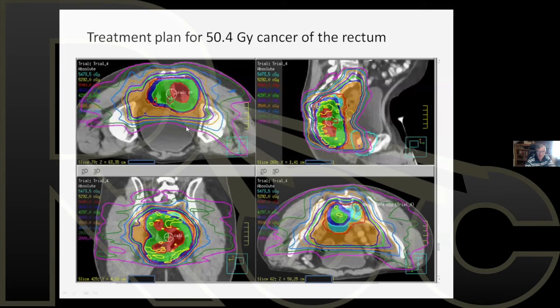You can see the outline here in red, the GTV. And then we have in blue all around it the PTV. The doctor put a very generous margin around this, and wants all of this treated because there are some nodes included also.